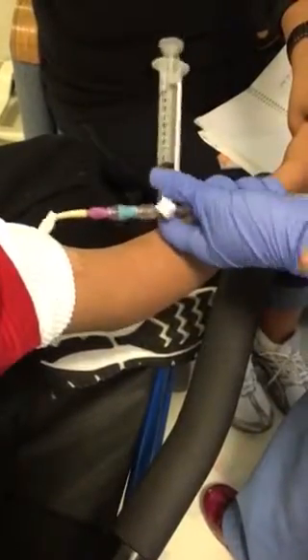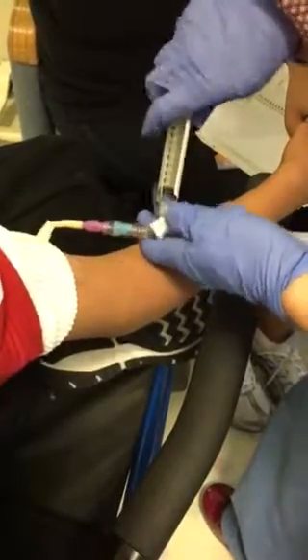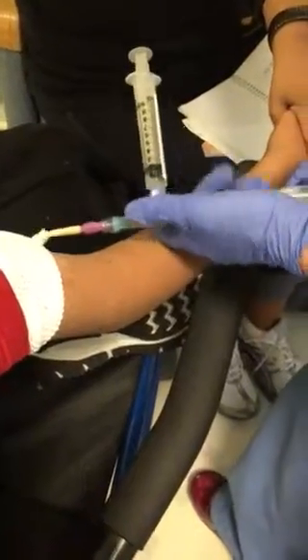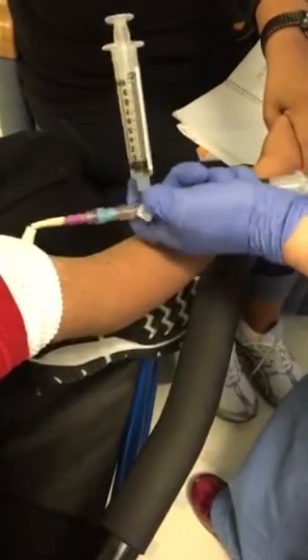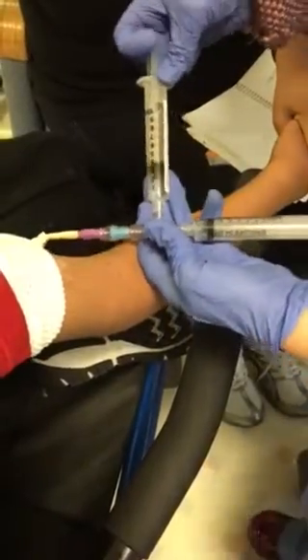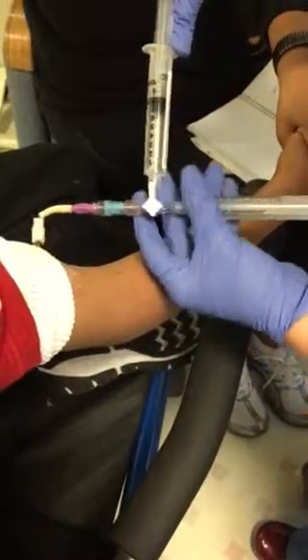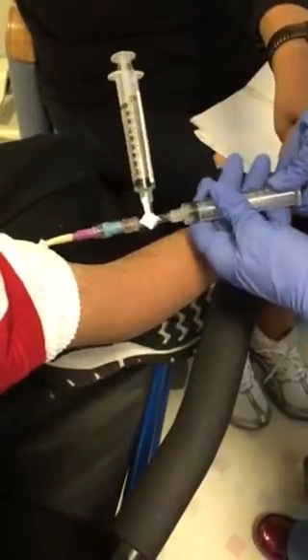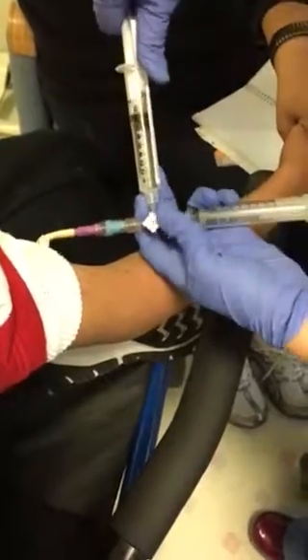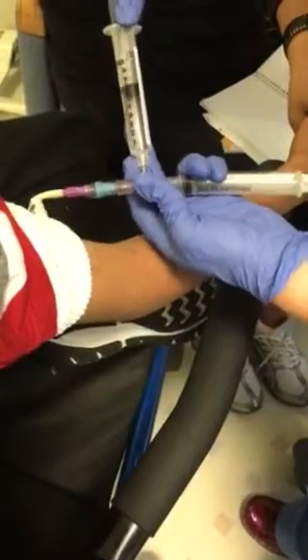And I'm going to intermittently check to see if I can flush anything into the catheter or if I start to get blood return. So I'm going to pull it back at the 8 cc mark, turn to the off, let go. So you can either do one side at a time, or you can go back and forth.